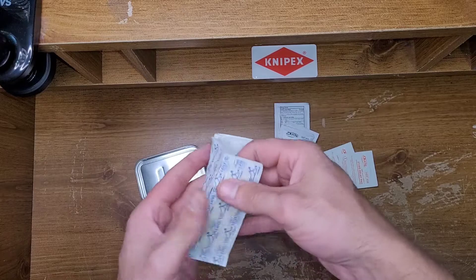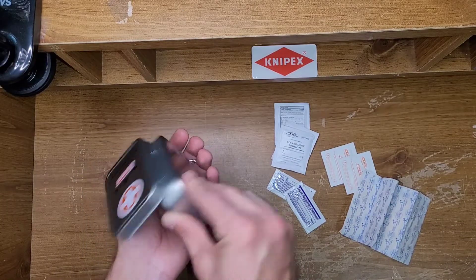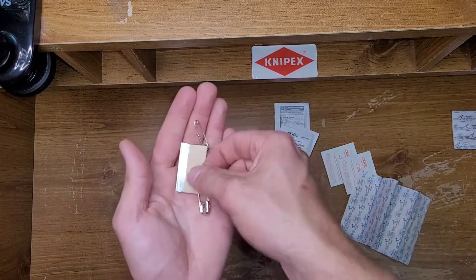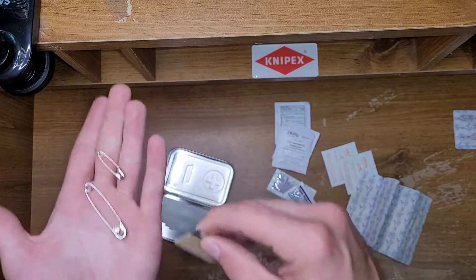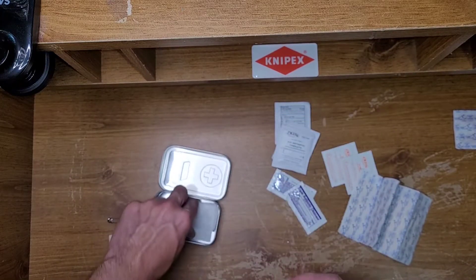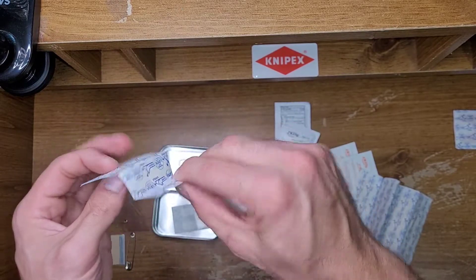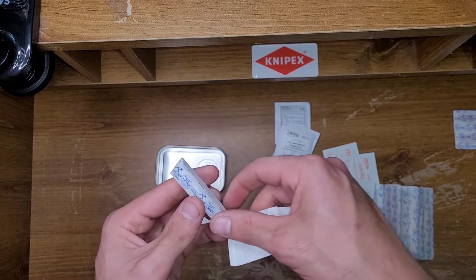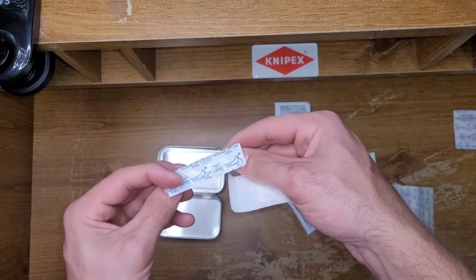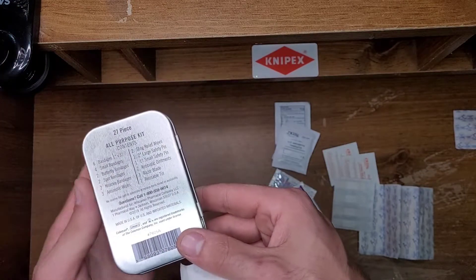A couple of band-aids — six band-aids, normal size. A couple of knuckle band-aids, two of them. A razor blade, which I'm kind of unsure as to why. Two different size needles. Four of these tiny little baby band-aids. Two of these — I don't actually know what these are, if these are like nose strips or a Z-strip type closure thing. What does the label say? Small bandages, I guess.